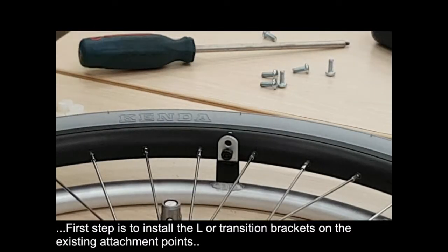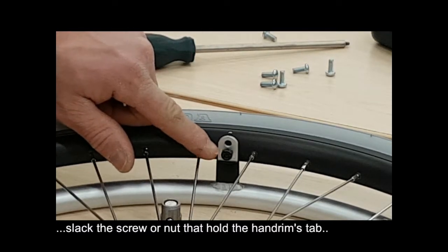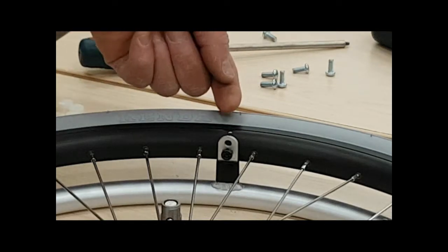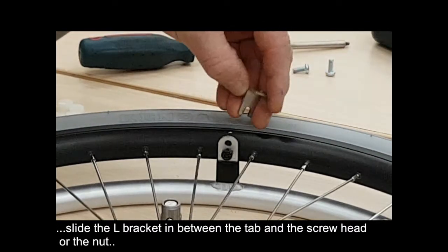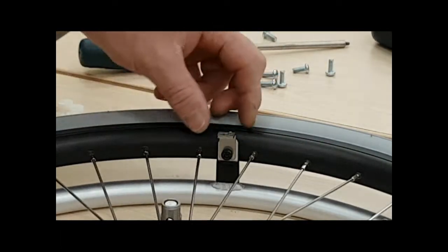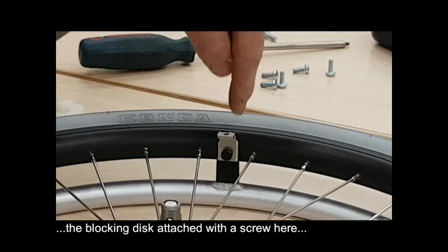Let's install the transition brackets. We're going to install the transition bracket over the existing attachment tab or the screws. First of all, we slack the screw or the nut, if you are dealing with a stud that goes from inside of the tire toward the outside. Then you just slide the bracket in place over the screw or the stud like this. You make sure that the flat surface here is parallel to the table like this, because we're going to be attaching the screws that will hold the blocking disc this way.